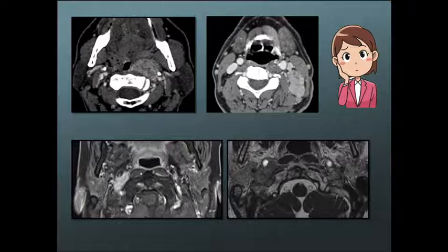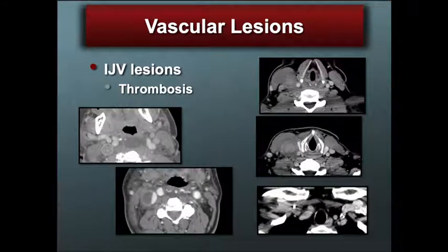So, of course, things can look similar, but you have to use all your additional tools to appropriately diagnose those cases. And we'll finish by talking about the vascular lesions that can occur in the space.